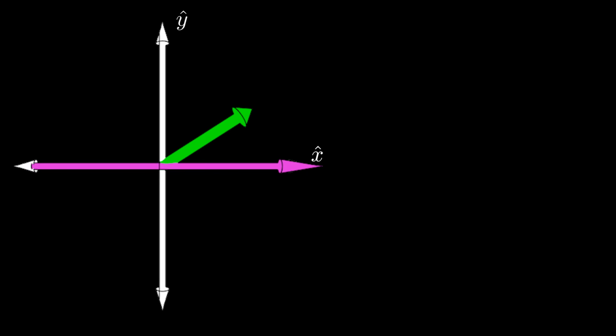Okay, so why does this work? Well, the reason is that our spins have acquired a certain amount of phase at time tau following the 90-degree pulse, and the 180-degree pulse effectively reverses or negates this phase accumulation. So let's examine a spin with a negative gamma here so that the angle theta of our spin would just be positive omega t, which is a little easier to work with in the argand plane.